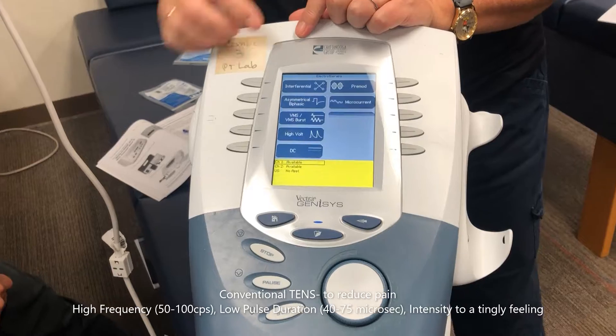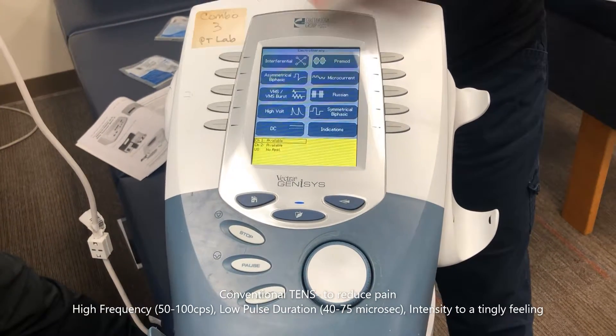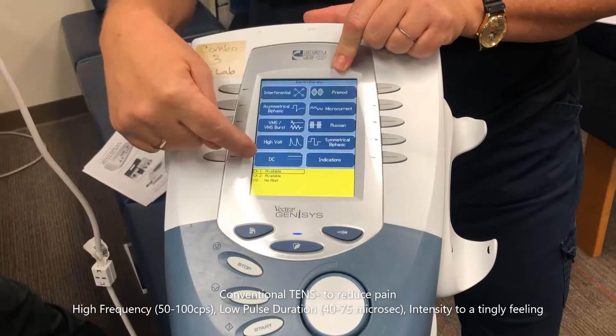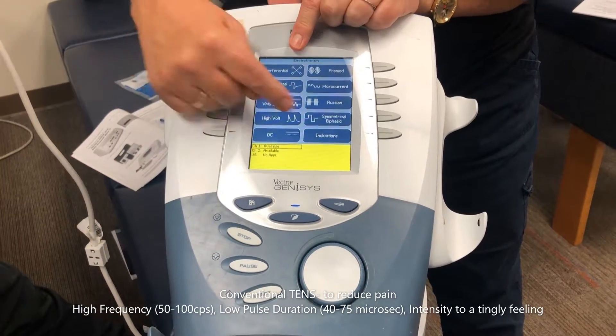We've covered several electrotherapy modalities: interferential, where you use four pads; pre-mod, where you set up two separate channels — both are medium frequency — and high volt.